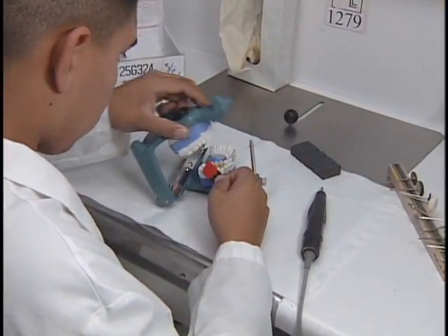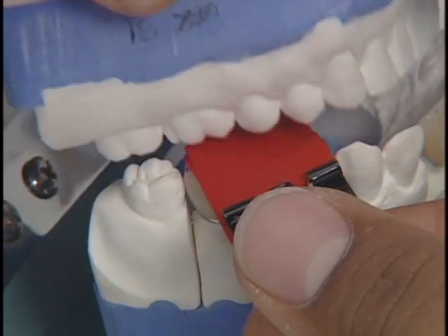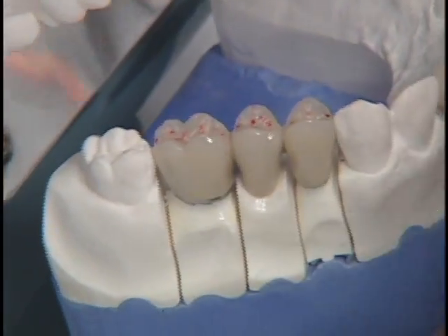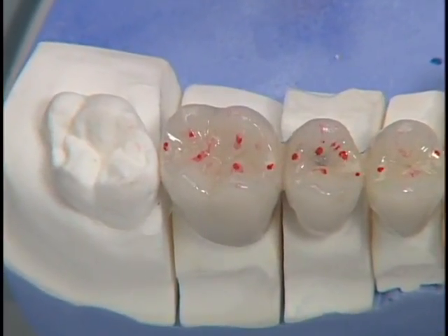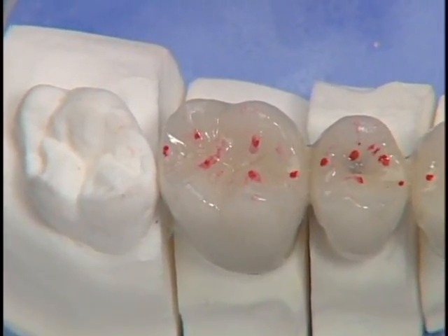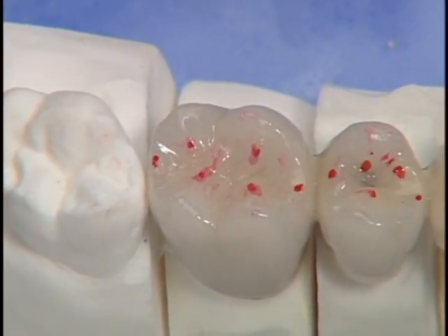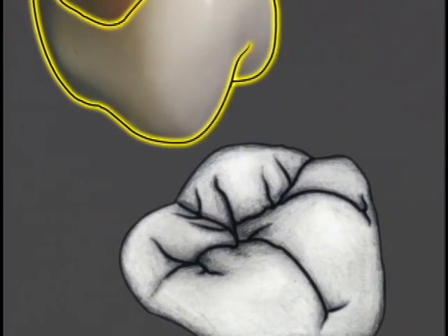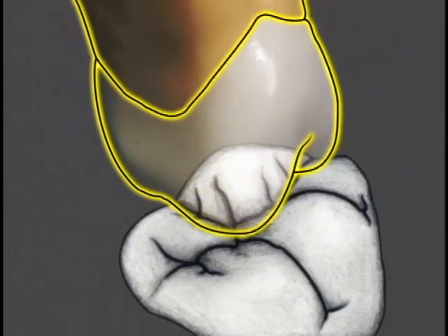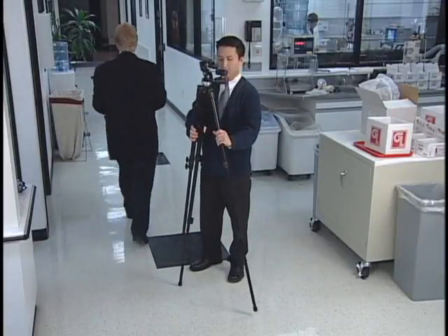If you want to create teeth that are balanced and stable when they occlude with the opposing dentition, you need to understand the concept of tripodized occlusion. Tripodized occlusion is a cusp-fossa relationship where the stamp cusp has 3 points of contact with the opposing fossa. When each cusp and fossa is tripodized, it creates a solid, balanced occlusion by directing masticatory forces along the long axis of the tooth. It's just like with a tripod.